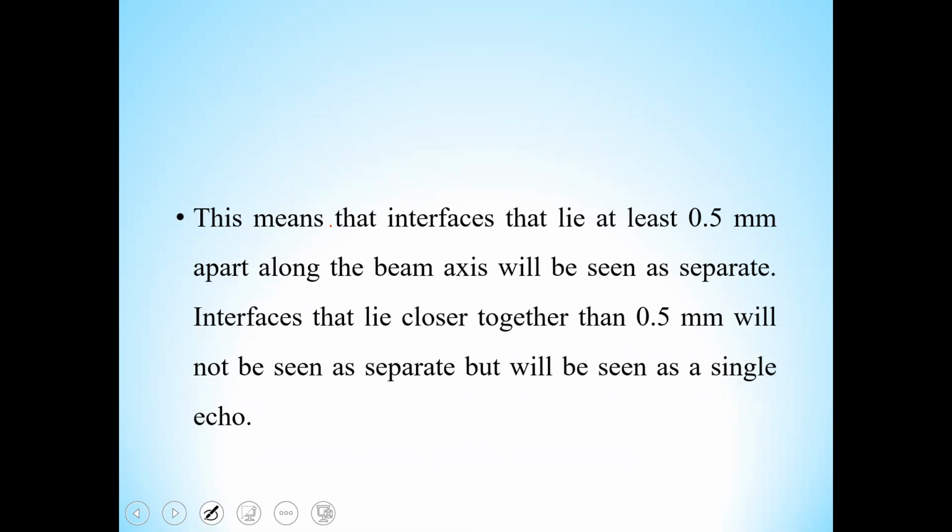This means that interfaces that lie at a distance of 0.5 mm or more, you will be able to see those structures separated from each other.